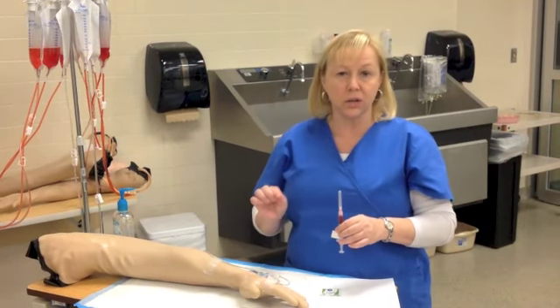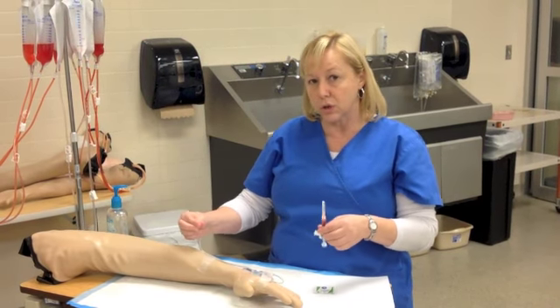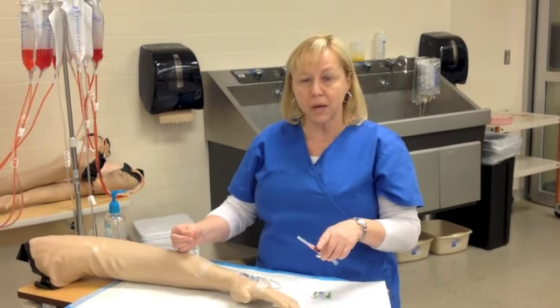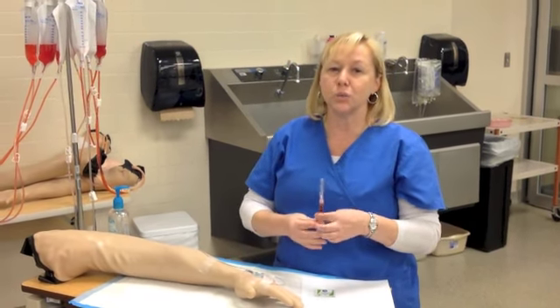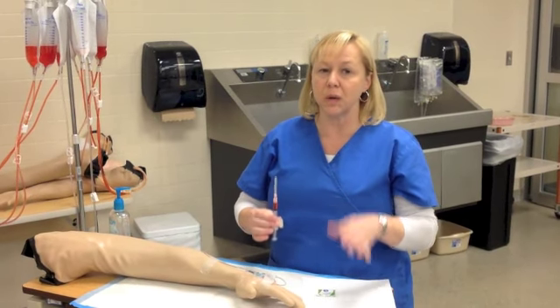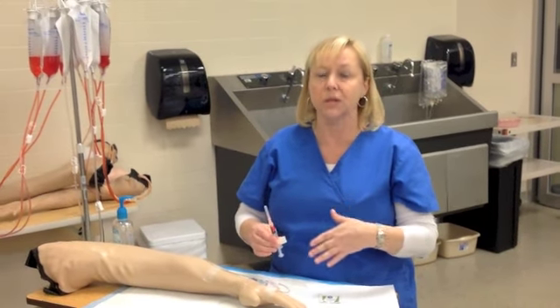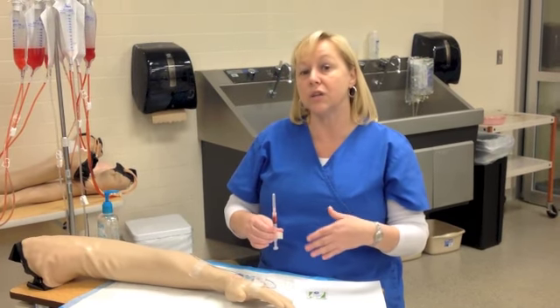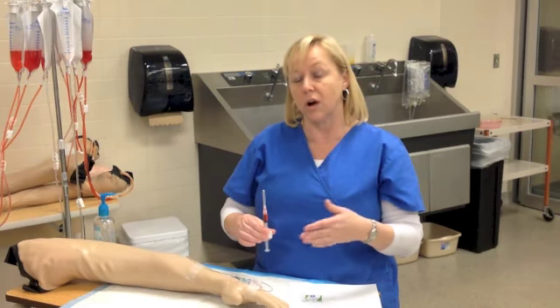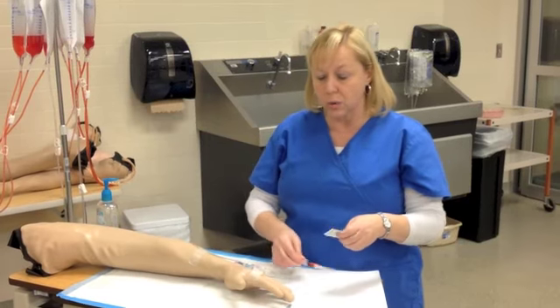Some instructors may tell you when you're at the hospital that when you're doing this you need to clamp your tubing, push a little bit of medicine, unclamp your tubing and let it run through, but that's really not necessarily the case, especially with our pump system now. So if you are in a clinical setting and this happens, simply do what your instructor asks you to do, but it's not necessary, or explain to them the reason that it's not, and we'll take up the issues from there. So now I'm going to show you what we need to do from there.